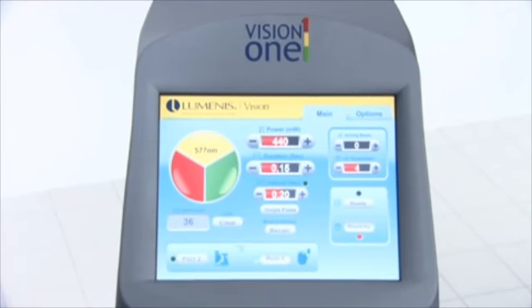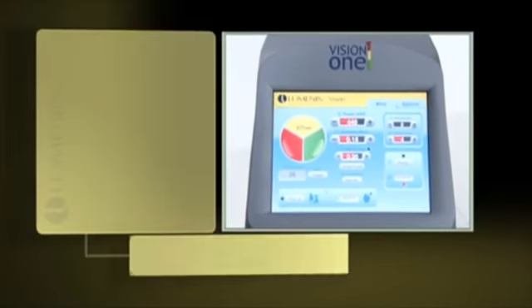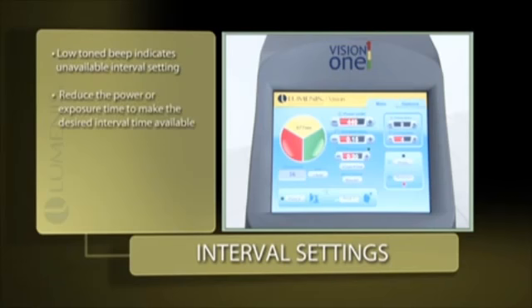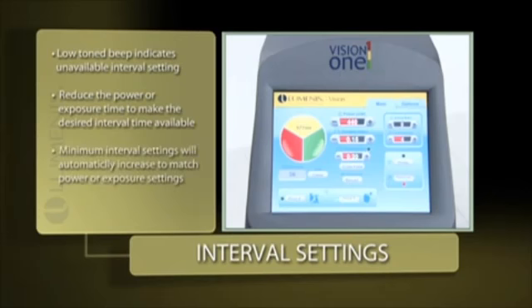Not all interval settings are available at the higher power and exposure time settings. If you attempt to select an interval that is unavailable at the existing power and exposure time settings, the laser emits a low-tone beep to indicate that the selection is not available. You must reduce the power or exposure time setting to make available the desired interval. Conversely, if you select the minimum interval for the existing power and exposure time settings, and then you increase the power or exposure time setting, the interval automatically increases to the minimum setting for the new power and exposure time settings.